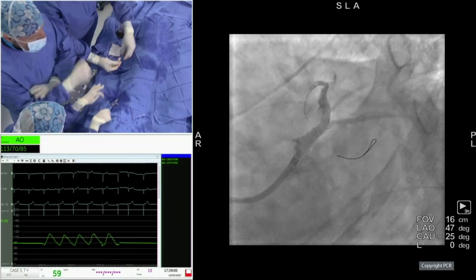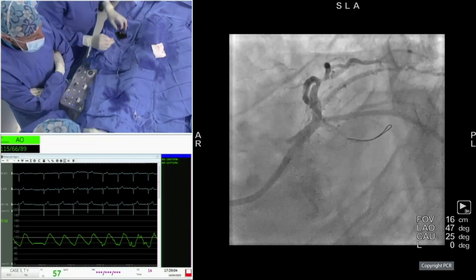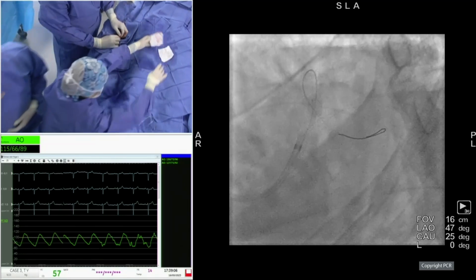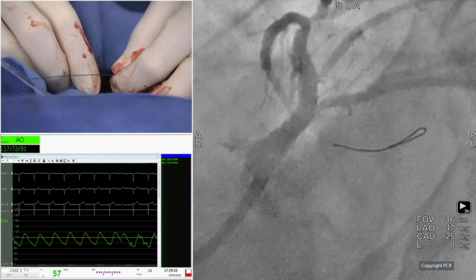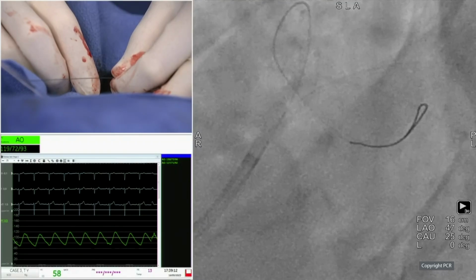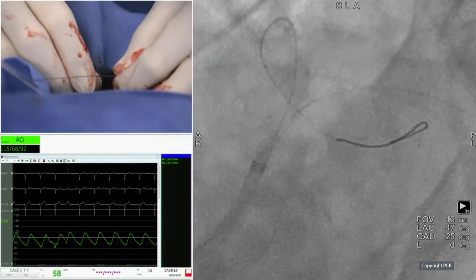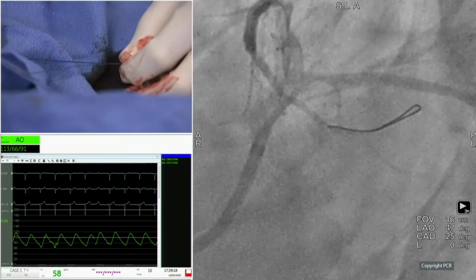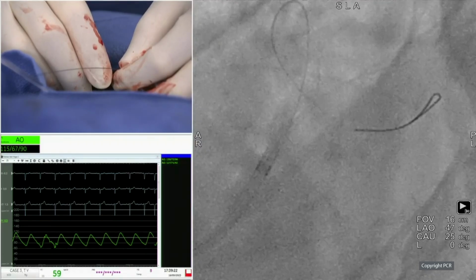Here you had enough lumen to put your IVL balloon immediately. If you were to do this with rotablation, you would have to go to a 1.5 or 1.75 burr, which will cause a lot more embolization, etc. So I think it's a neat way to do it with the IVL. But as you mentioned, when it's an extremely tight lesion, you can make a progression from one to the other.